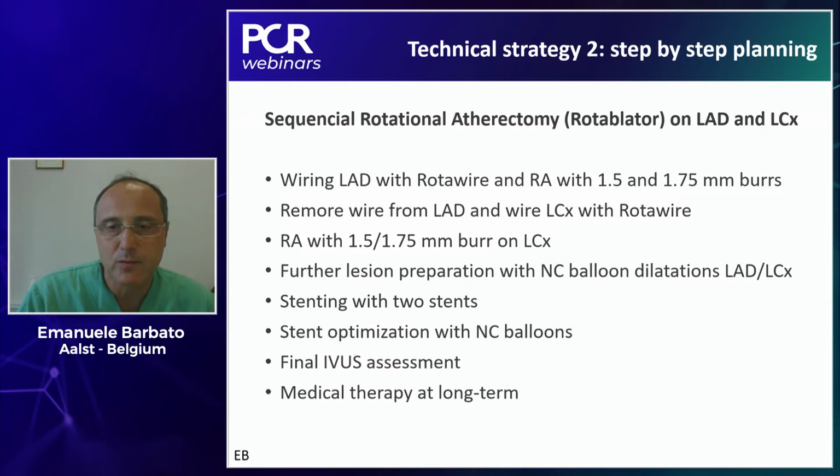Then I think most of us would agree that this is a case for a two-stenting strategy. It is a true Medina 1-1-1. Then we can discuss about the specific stenting technique, but it's very likely that we will end up with two stents implanted in this case.